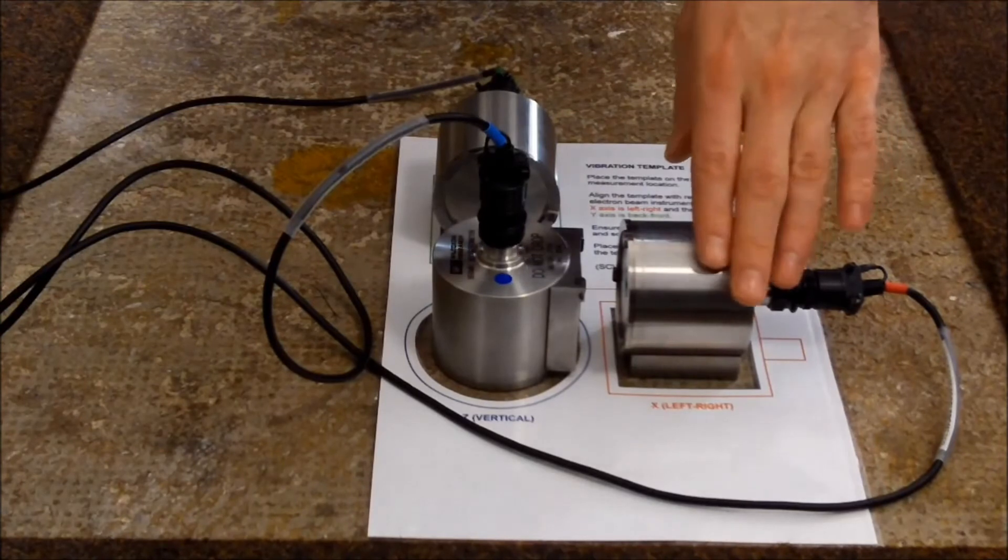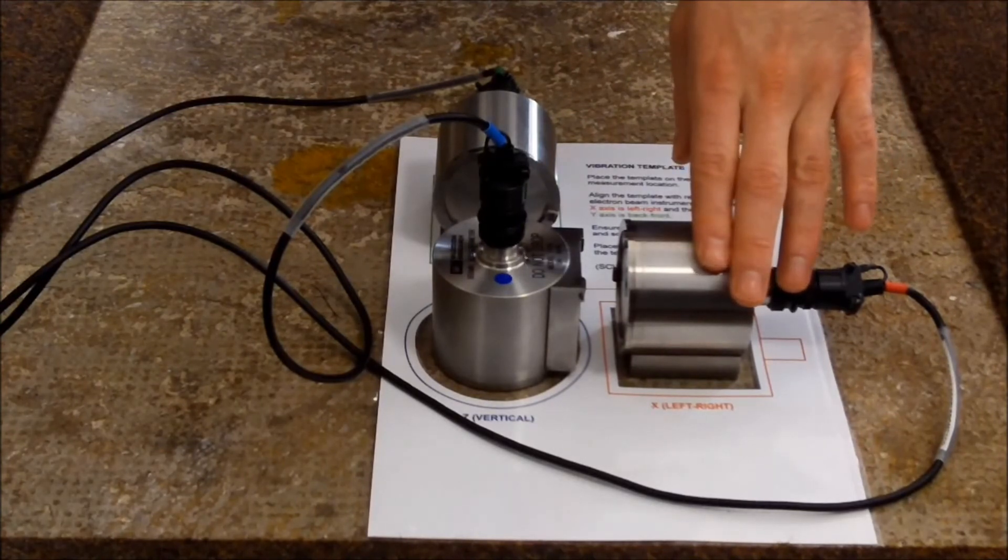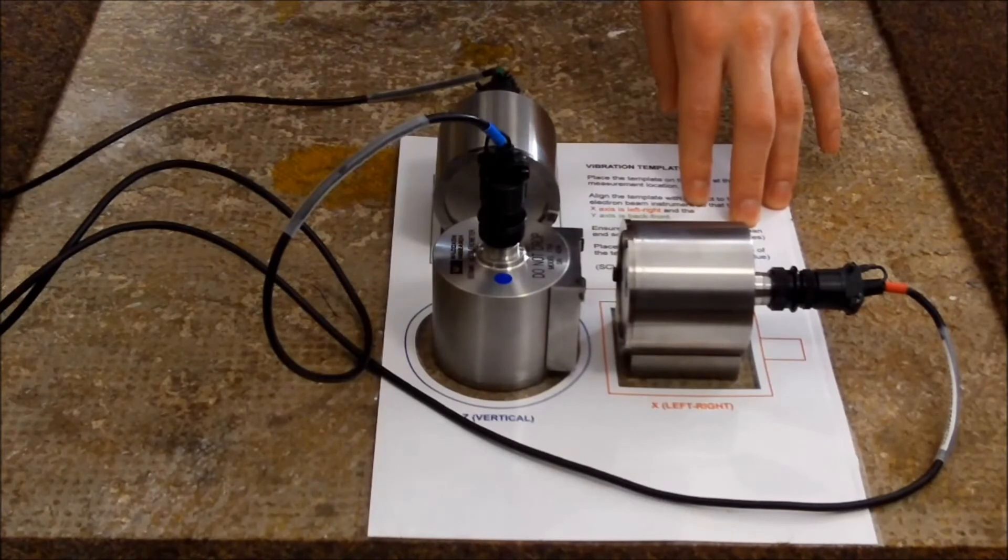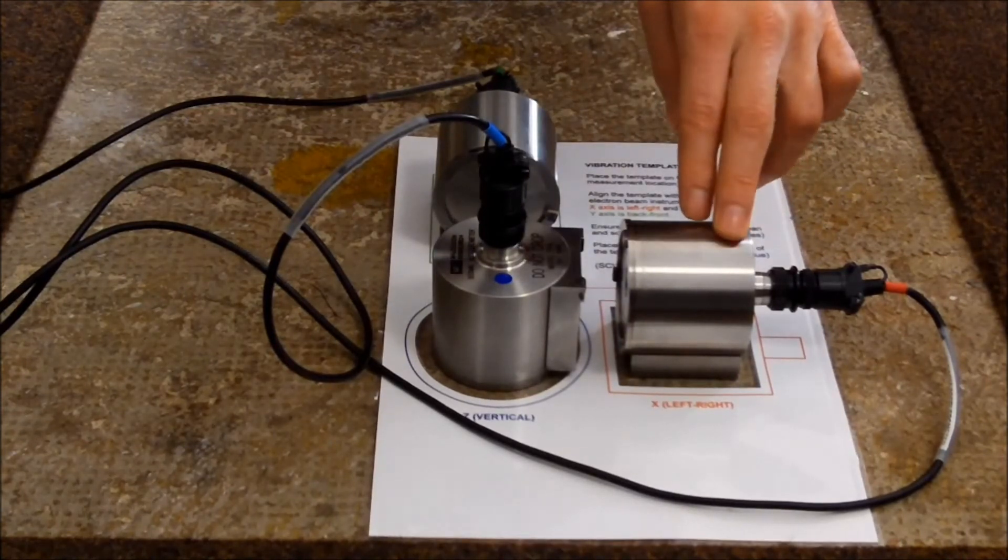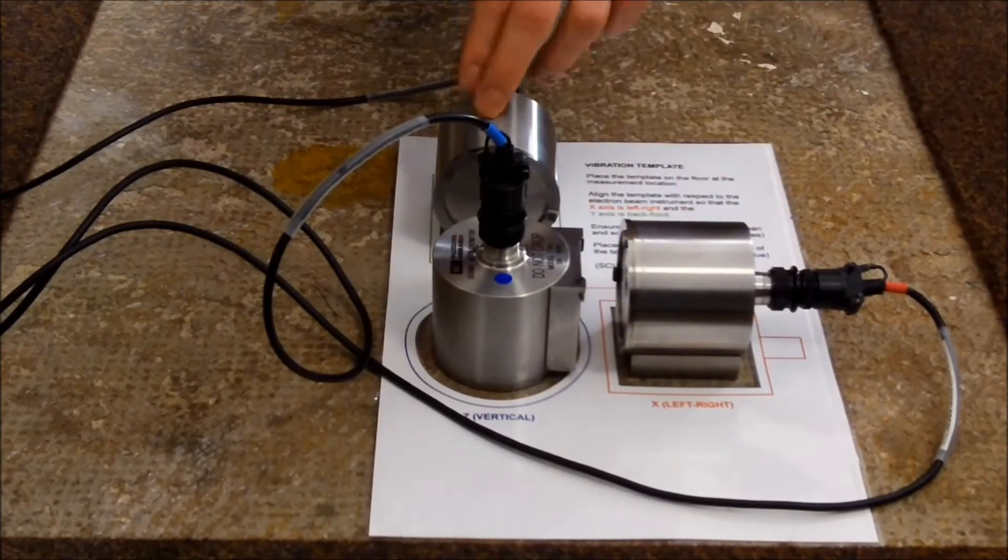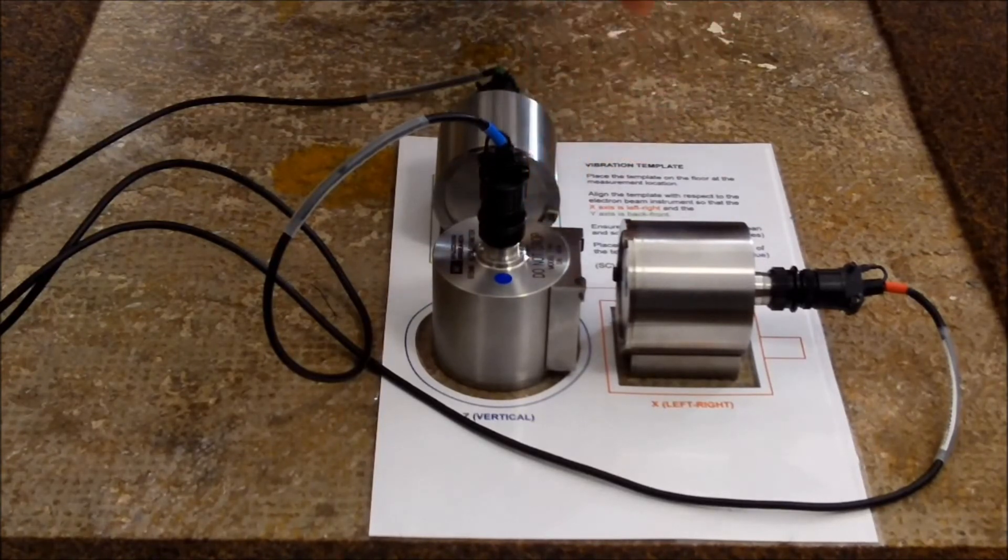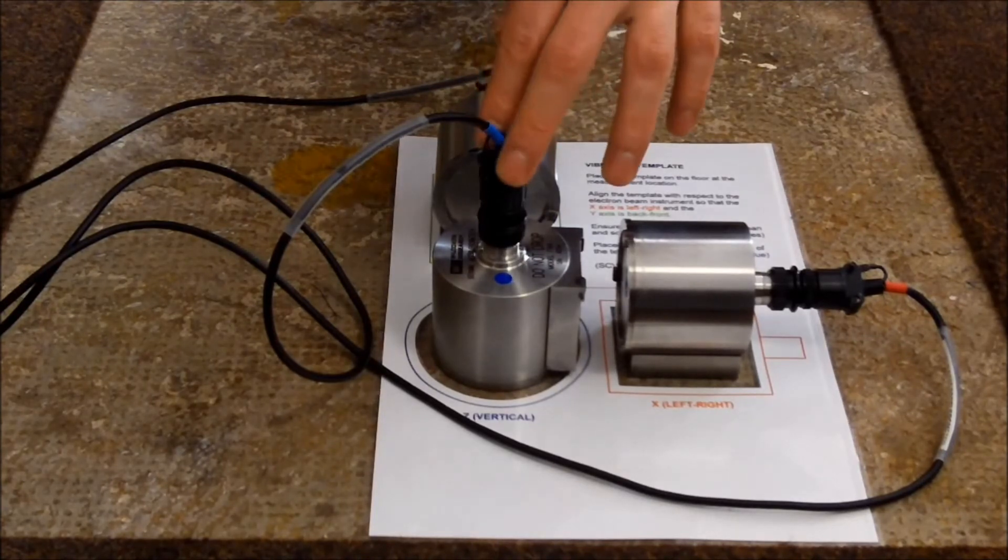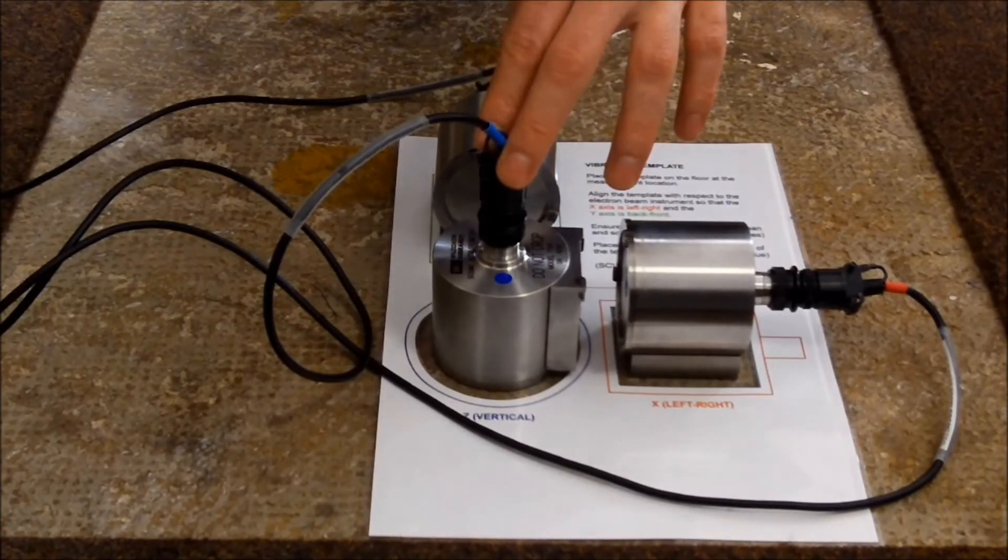First of all, put the accelerometers in their correct position. Align the vibration template with the axis of the instrument for which you are making the survey. X is left to right, Y is back to front, and Z is vertical. Use the template to align the sensors along the X, Y and Z axis. Match the color coding of the directions on the template to the sensor colors.